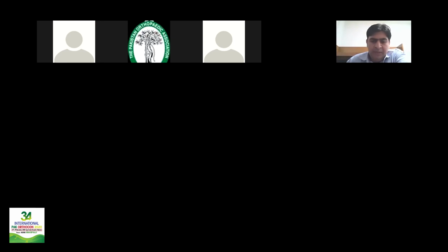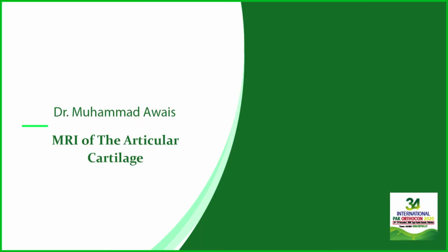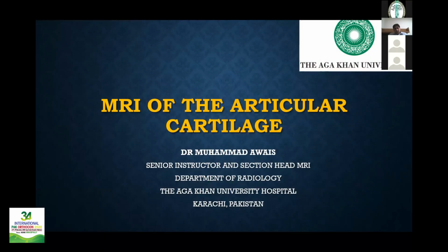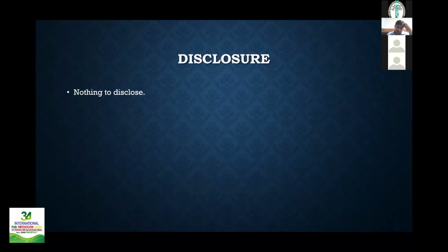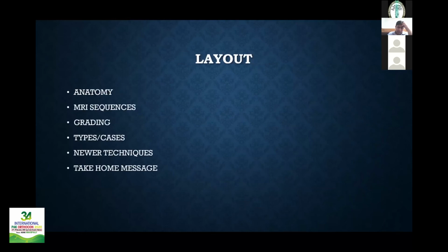So let me now present my final presentation on the MRI of the articular cartilage. I will be talking about the MRI of the articular cartilage, and that will include the patellar articular cartilage as well as the tibiofemoral cartilage. I have no conflicts of interest to disclose.